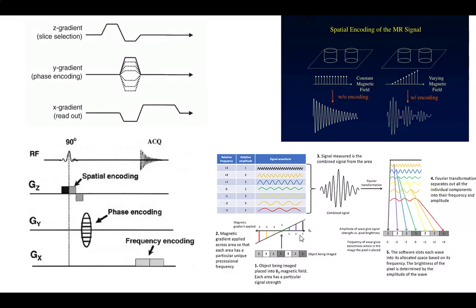So just to make sure, I've got one more little thing that will let you look through this. Again, I copied that same picture over. So right here, this is our spatial encoding, our GZ, and that is in tune with the RF kick. That's what starts the whole beast. When that is done, I have to correct it when I come back out. I do my phase shift. It could be at different levels. You have to do that right after.